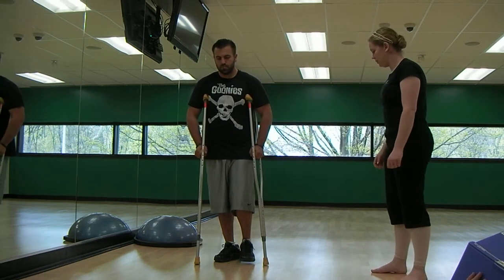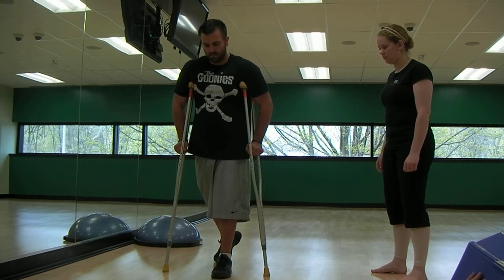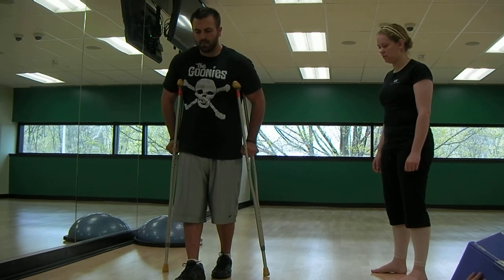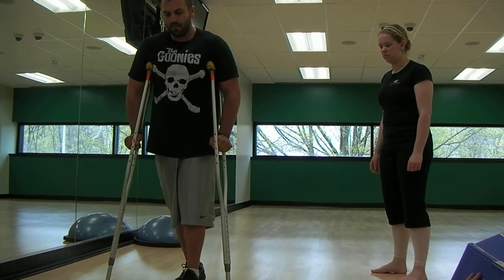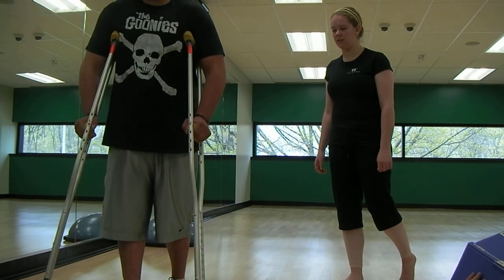So let me see you do that. Take a few steps. Alright, looks good.